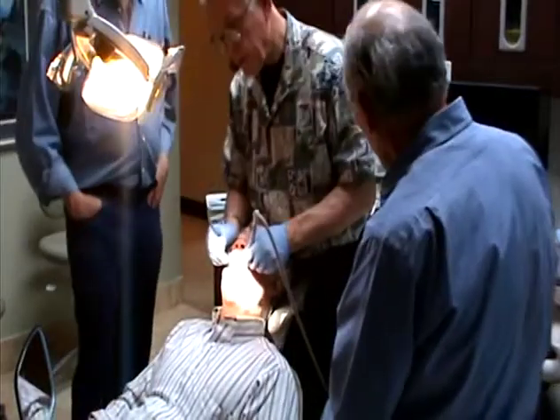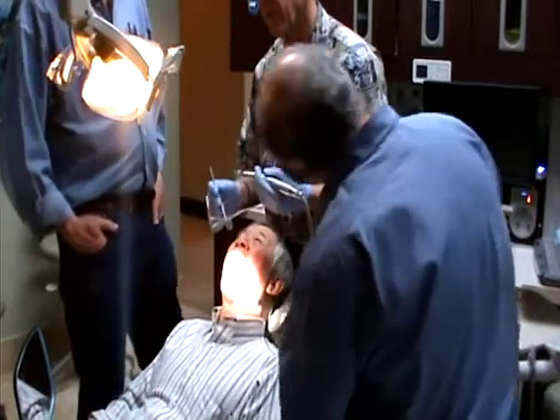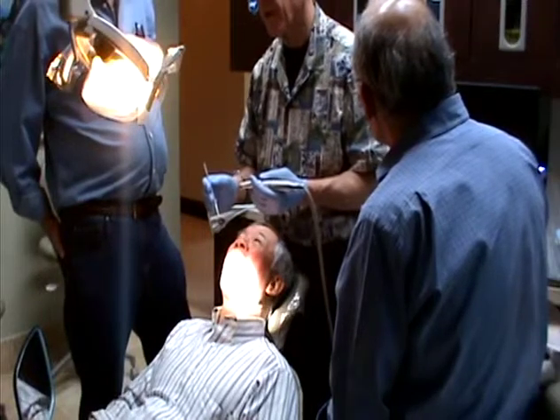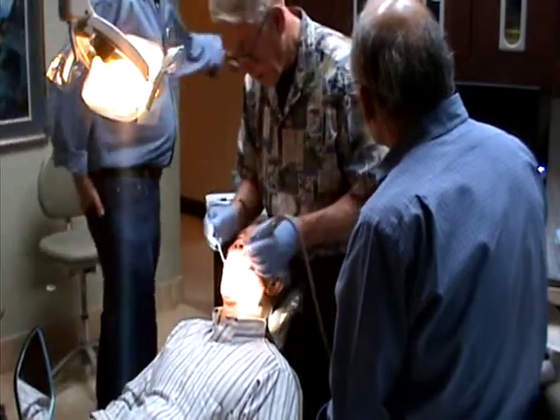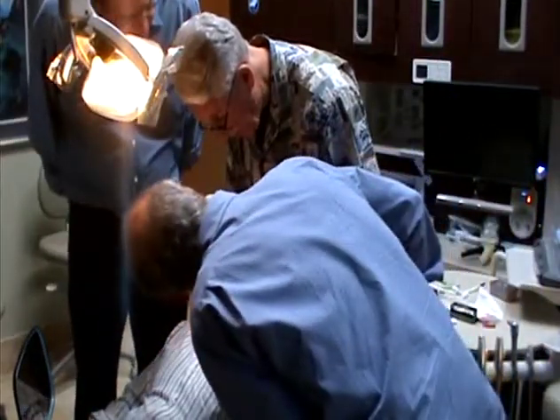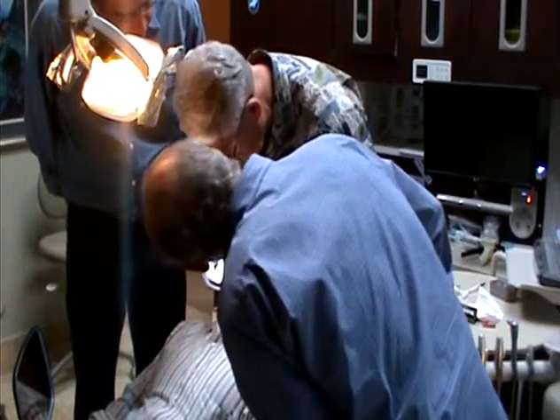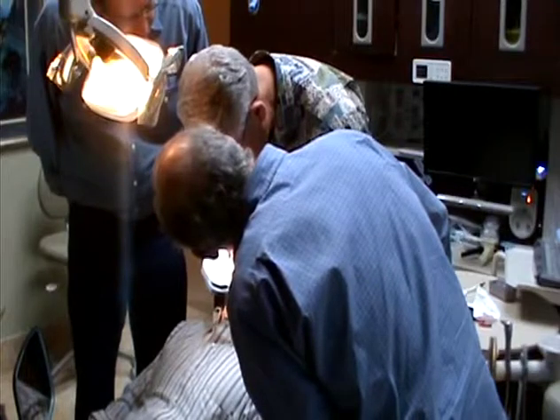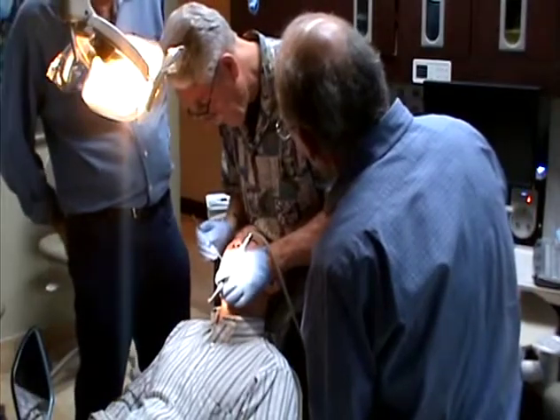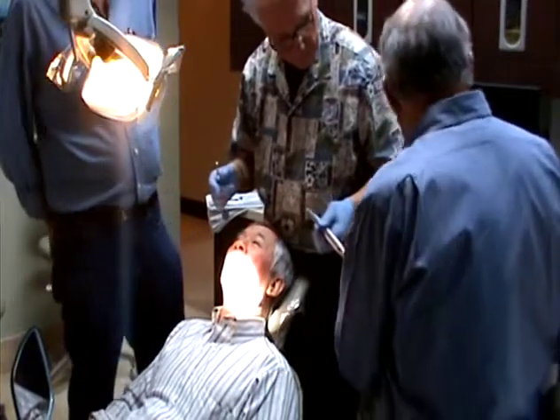And back here, when he slid on this tooth, this thing fits up underneath the second molar on the top. So when he slid out through there, he was banging on it right across the inside of this. You took that away. Yeah, that's all gone now. Slide that one. I feel a little something again. When you slide right, slide to the left. Do you still feel that balancing interference over there?